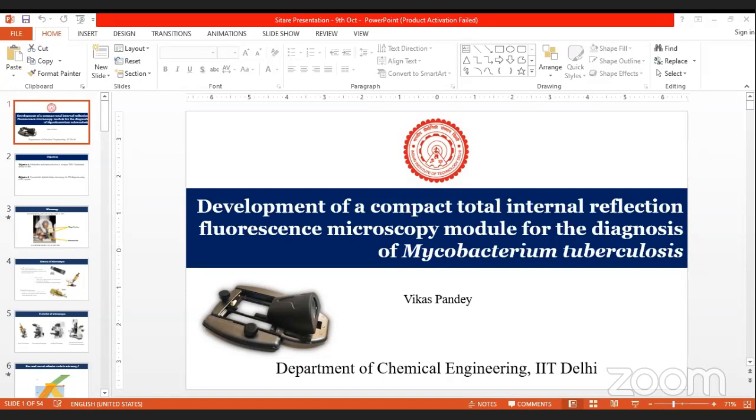Yes, sir. Another question: is the stain used acid fast stain itself, or is there any other stain? Acid fast staining. Okay, sir, thank you, sir. Yes, it's the WHO recommended auramine O staining only. Okay, sir.